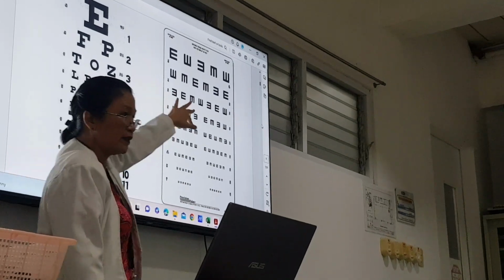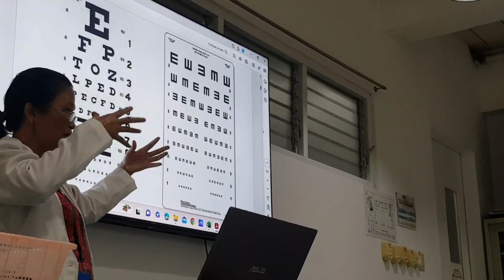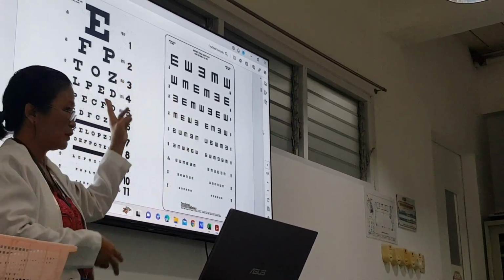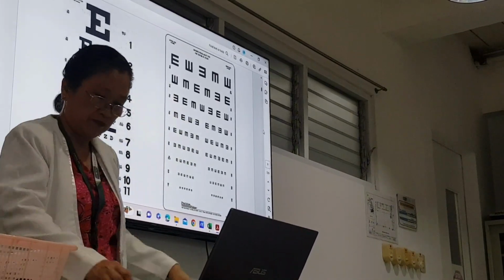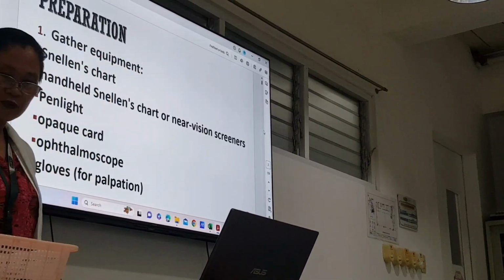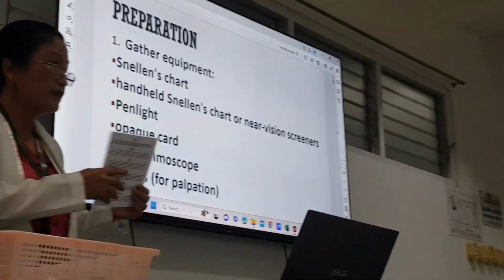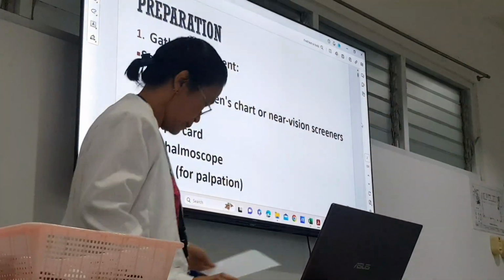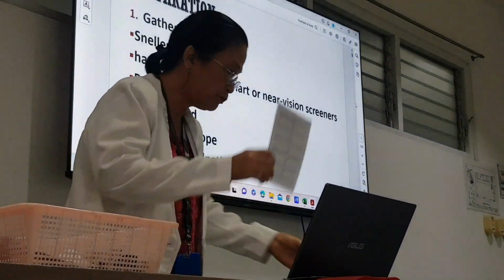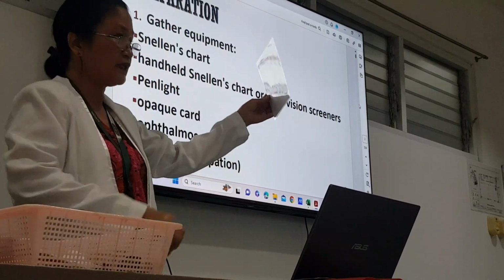Kung paano pataas yung paa, whatever. That is your Snellen chart. Okay? And then your handheld Snellen chart or near vision screeners, this one. Nag-download po ako ng Jaeger's Snellen chart, kaya ito ang gagamitin natin.